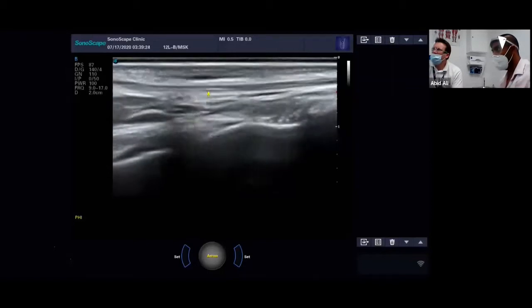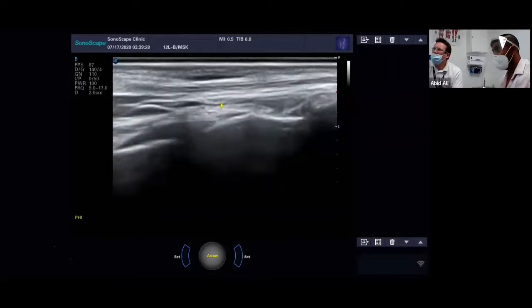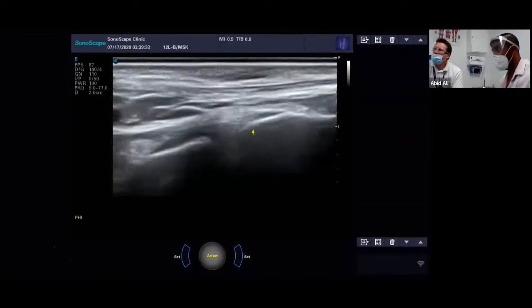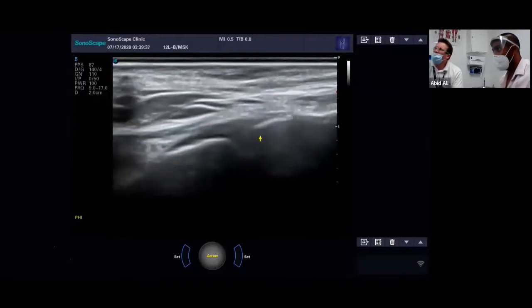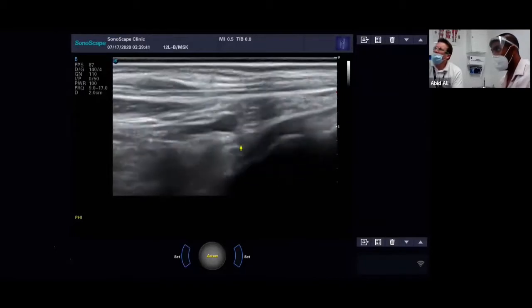That's a nice way of trying to pick it up. If you're really just lost in the deep blue sea there, just move things. The good thing about the foot and ankle is it's not a particularly deep structure. It's quite straightforward to get to see the structures. But of course, it's the contours that you have a bit of a problem with. But the secret there is plenty of gel.